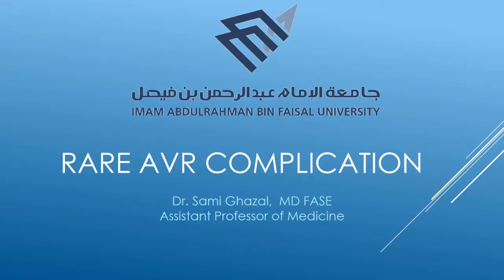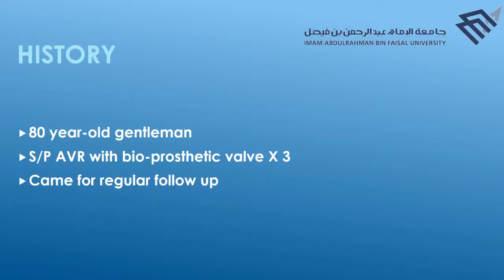This is Dr. Gazal. I'll be presenting to you a rare aortic valve case complication along with some hemodynamics. So in short, our case is an 80-year-old gentleman. He had aortic valve replacement with a bioprosthetic valve 3 times. He came for a regular follow-up in our echocardiography lab.